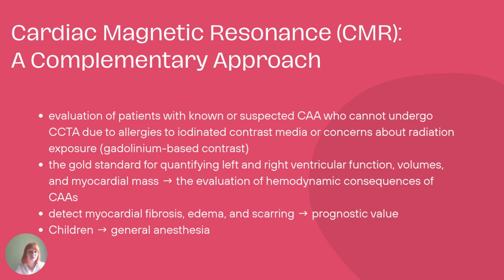Cardiac magnetic resonance, complementary approach. It is a good tool for patients that cannot undergo CCTA due to allergies to contrast media or due to some concerns about radiation exposure. For example, for children or pregnant women. And it is a gold standard for quantifying left and right ventricular function, volumes, and myocardial mass.